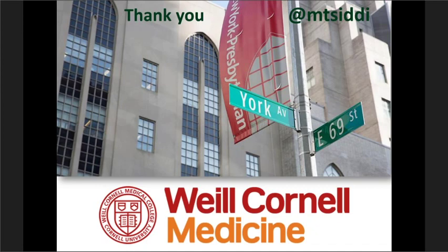Last question is, what's the discrepancy rate in grading pancreatic neuroendocrine tumors on cell blocks versus the subsequent resection? In the sense, are they upgraded, downgraded, or are they the same compared to the cell block material, just because it's a small sample? I don't have any definitive data in front of me right now, but anecdotally, we have had matches, complete one-on-one basis, between cytology and biopsy or resections at Cornell.